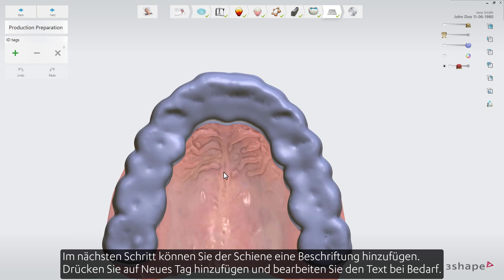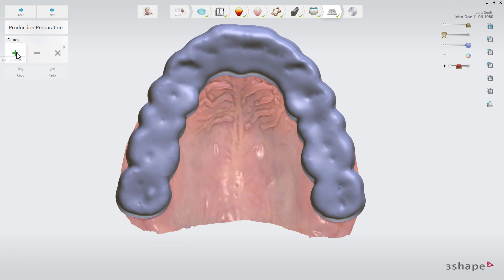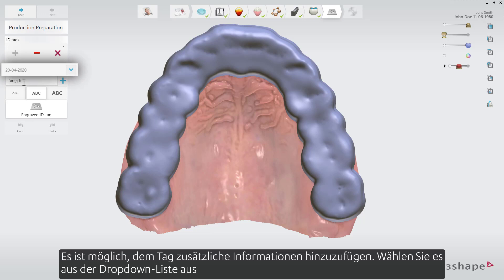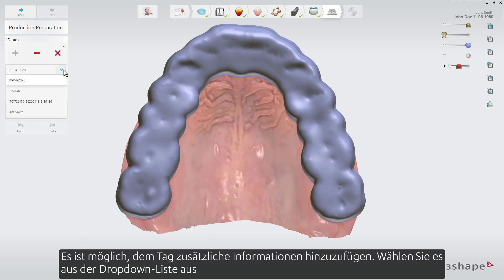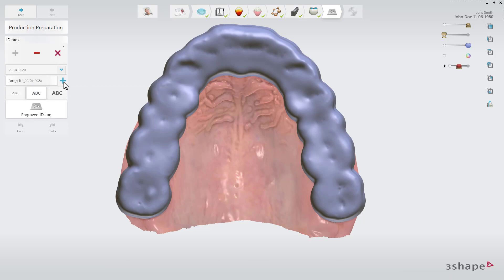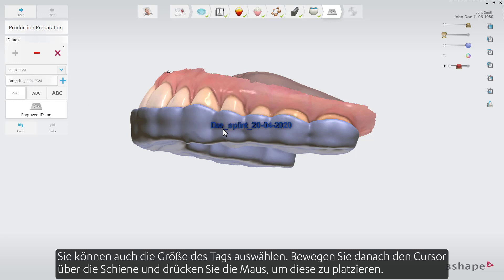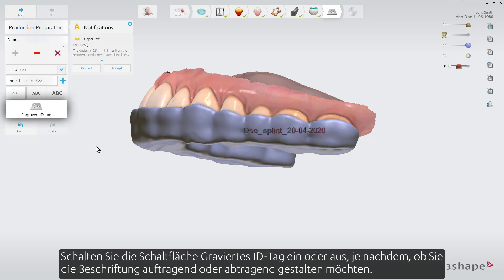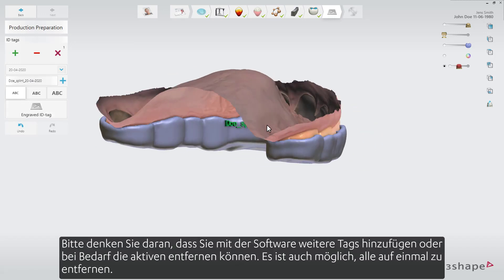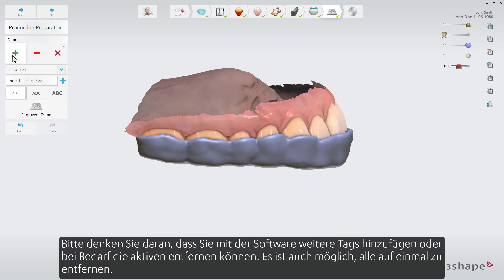In the next step you are able to add an ID tag on the splint. Press Add New Tag, then edit the text if you need. It is possible to add additional information to the tag — select it from the drop-down list and then press the plus icon next to the text field. You can also select the size of the tag. Move the cursor over the splint and press the mouse to place it. Toggle the engraved ID tag button on or off depending on what type of tag you want. The software enables you to add more tags or remove the active one if needed, and it's also possible to remove all of them at once.